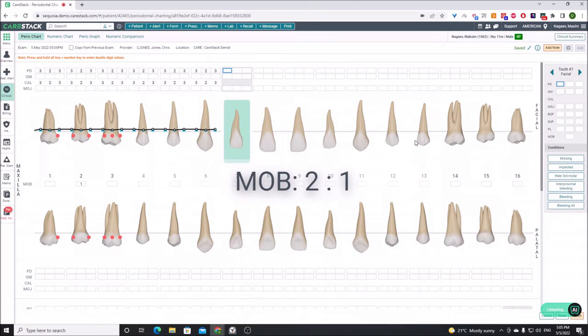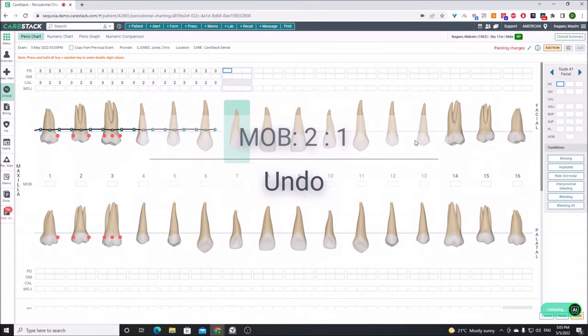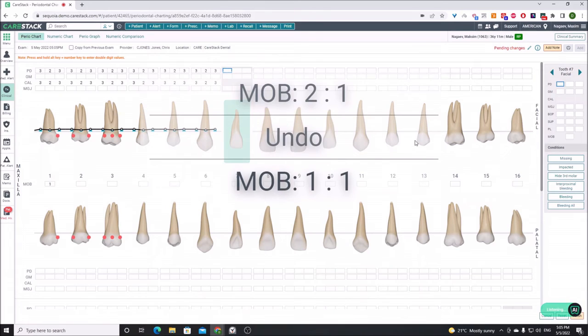Undo. Mobility, tooth number 1, class 1. Furcation, grade 2, tooth number 3.